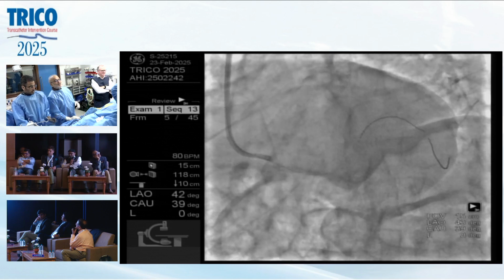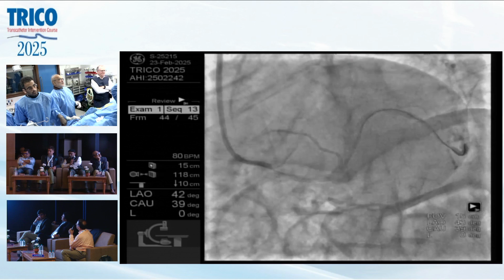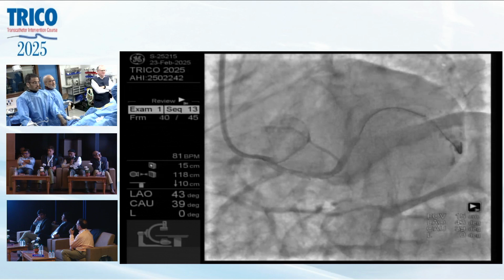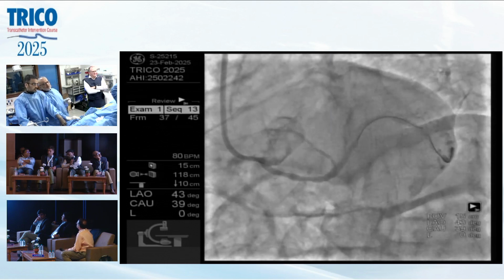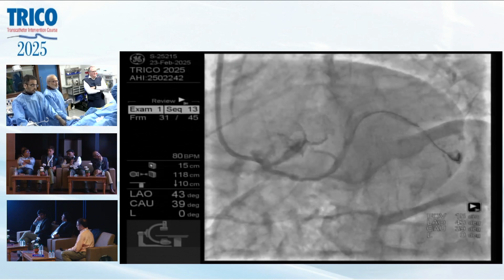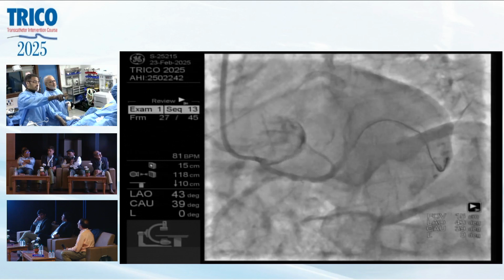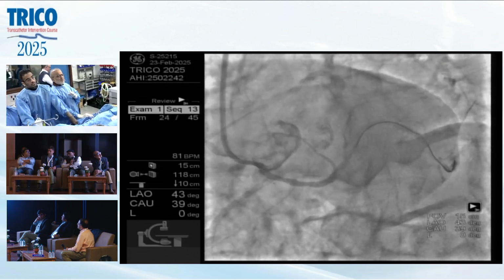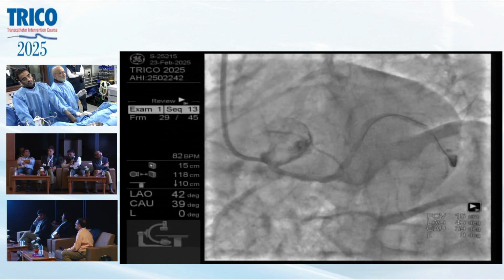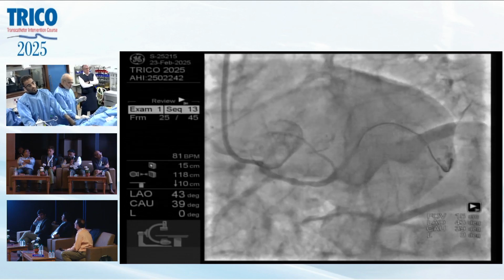Yeah, he feels that there is proximal disease, but in that case we have to take a long stent, right? Yep, I would stop at that branch almost, the superior branch. Then we can take 3 millimeter to start with, deploy at 10, 11, 12, come back and get a good pressure there. The proximal disease has been dilated by a balloon. Okay, but the balloon is 2 millimeter, so no issues. There's also some non-obstructive disease, very proximal, but a 2 millimeter balloon will not do anything to that area. This area is too big for a 2 millimeter balloon.